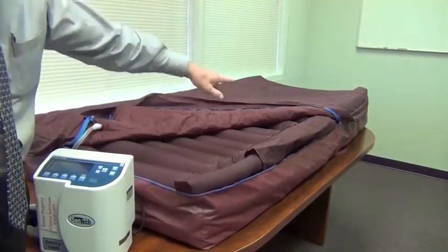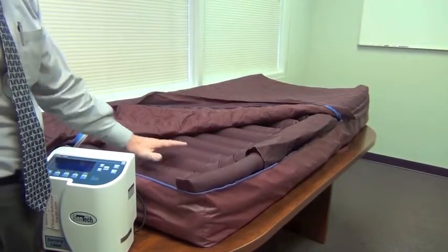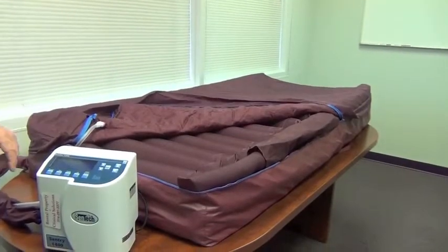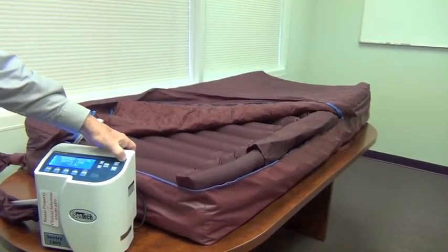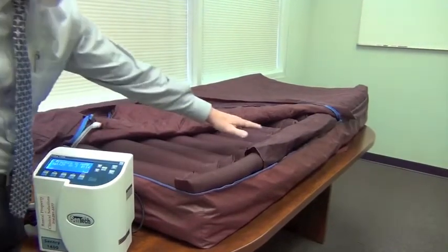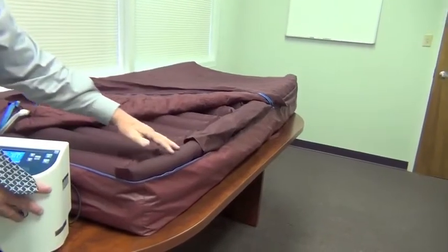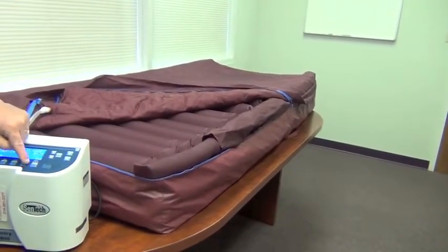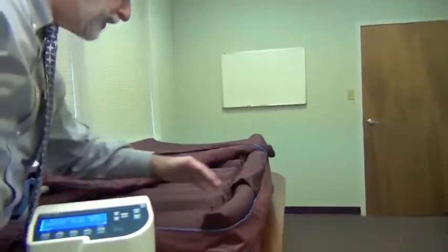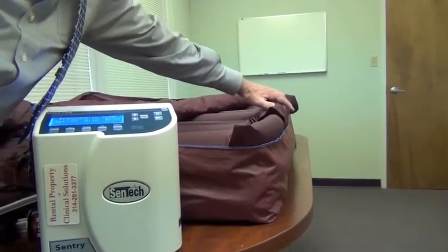It runs head to foot. It gives substance and integrity to the mattress itself, and on top of it are the accessory bolsters that I talked about. And I'm going to turn the unit on here just quickly and inflate these accessory bolsters. You can see right now they're flat. There's no additional height here. When I do inflate them by pushing the soft pad on the air supply here, you can see now that they begin to inflate, and in a matter of a few seconds they're inflated.